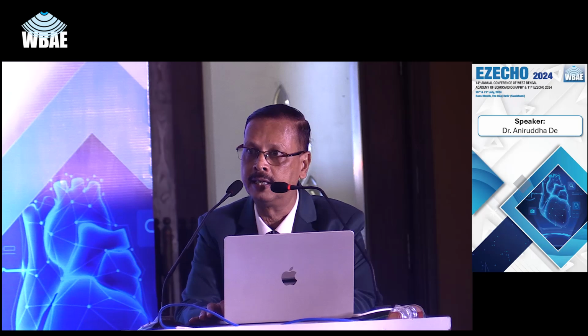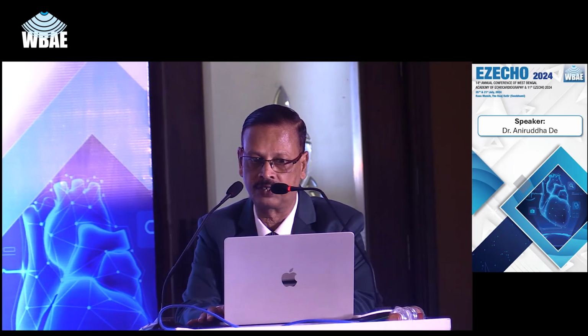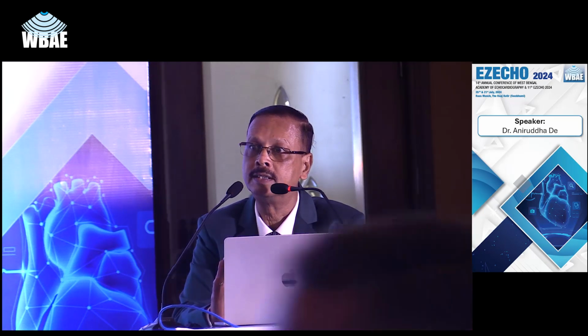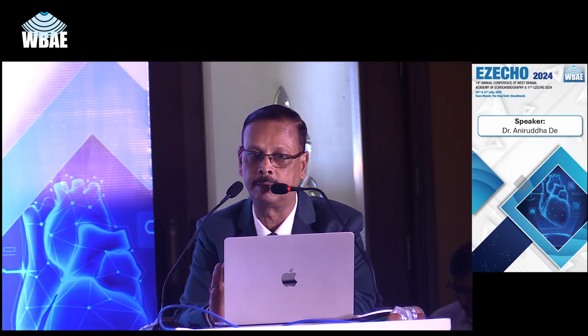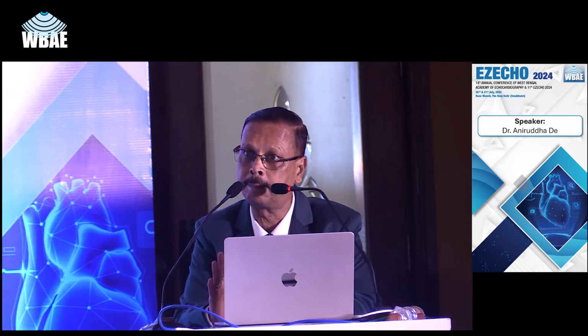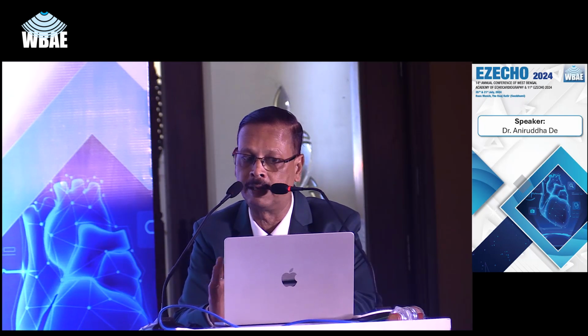What you see is a case of enlarged LA and good systolic function, biatrial enlargement. And this slide shows how to determine the increased LV filling pressure in atrial fibrillation. These are the parameters, but I'll go into them one by one.